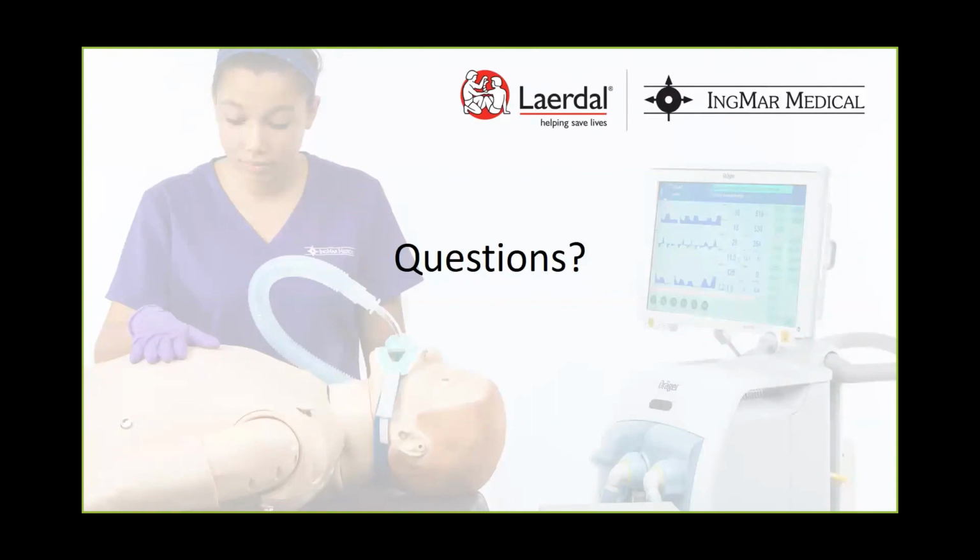Cassie, if you don't mind, I see one here that's a good question from Donna. Donna asked, do you no longer need an external air compressor when using the ASL 5000? So that is correct, Donna. An old solution that we had for making this integration happen did require an external compressor, but now that we've formed a more seamless integration with the SimMan, we're actually controlling the compressor that's located in the leg of the SimMan to produce the chest rise.